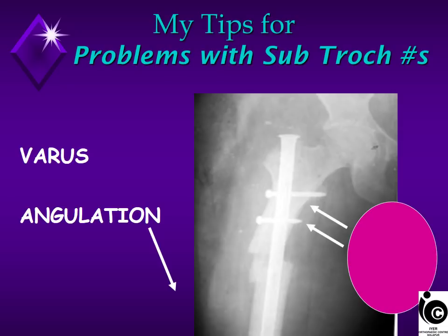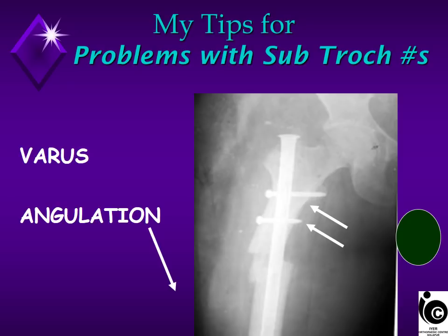My tips for operating a subtrochanteric fracture on an orthopedic table. Normally, the huge perineal post is a hindrance for these fractures. When you try to adduct the limb, the adduction happens at the fracture site and not at the hip. So use a smaller size perineal post that rests against the opposite side ischial tuberosity.